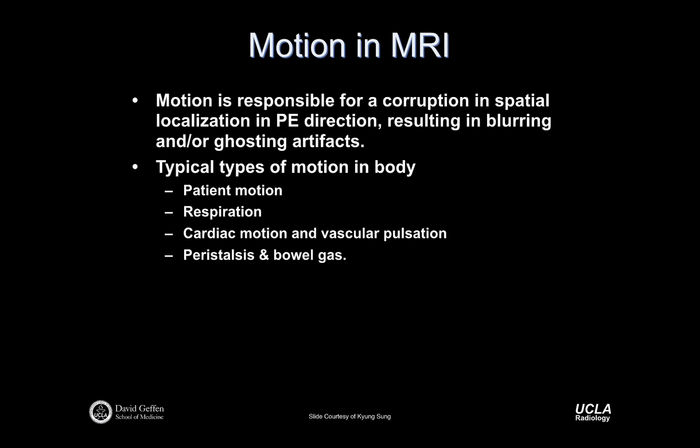And then obviously peristalsis, bowel gas movement, and so forth. That's a tougher problem to deal with, right? Difficult to monitor, difficult to know when it's happening, difficult to control, and yet can lead to imaging artifacts.